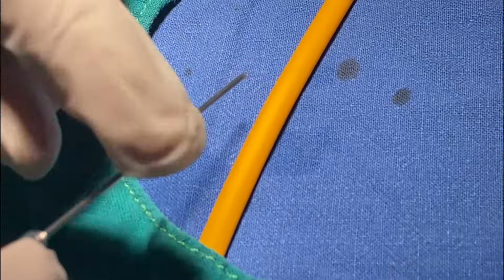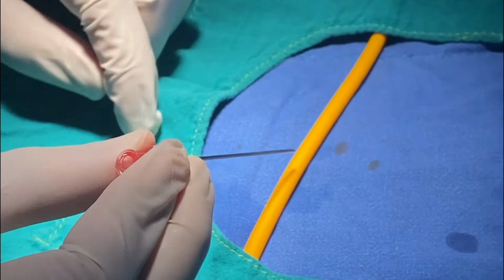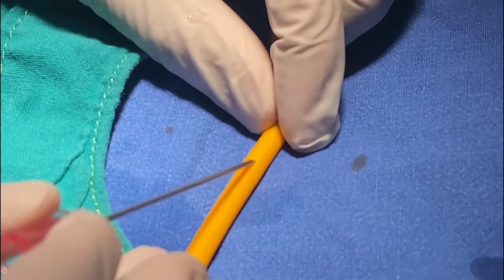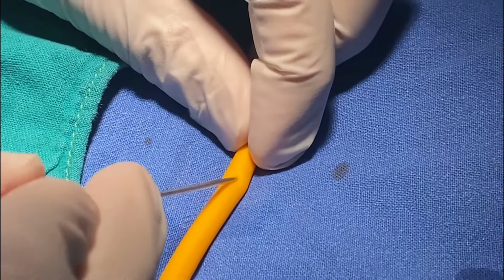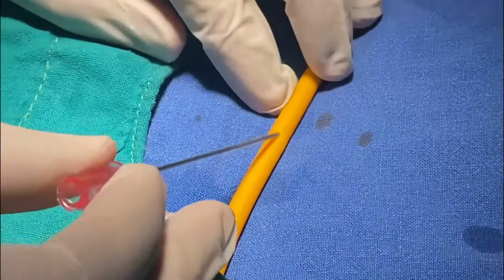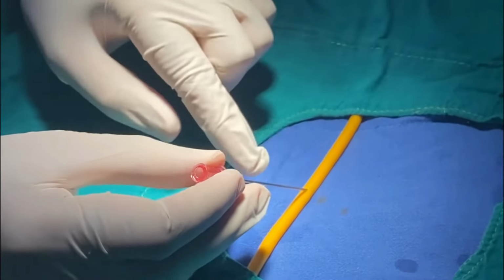So how do you puncture? Hold the puncture needle like this. Suppose this is the artery. Hold it like this. When you puncture the skin, it will go in. The bevel tip should be facing upwards. If it is facing downwards, once you puncture, the blood will start coming out at the systolic pressure. So always puncture at 45 degrees in the line of the artery.